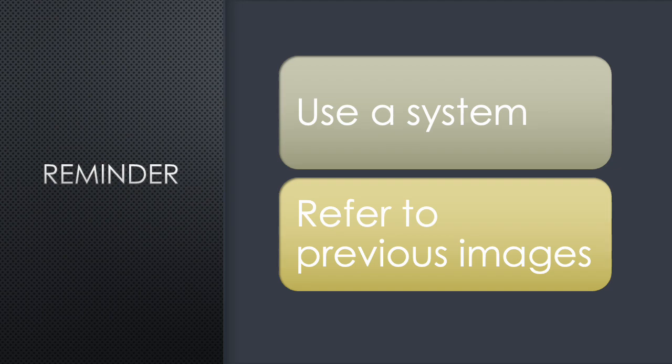As a reminder, look back at the introductory section, but we have gone through a couple of different approaches in terms of a system to look at CT scans. But remember, two key things to do are to use that system and to refer to previous images as well.